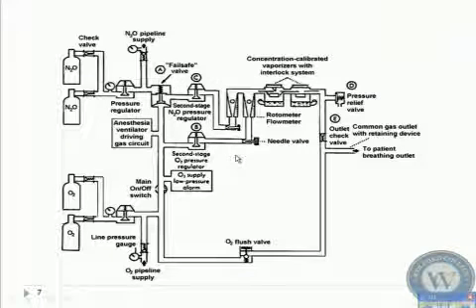Okay, and that's going to drop the pressure down to about 24 psi for nitrous and 16 psi for oxygen. You don't have to write that down. I've got all that in slides later. But now you're at a very tolerable, acceptable psi.